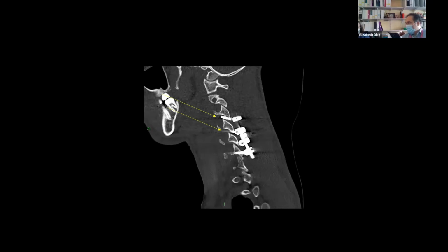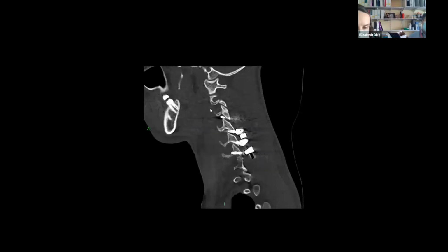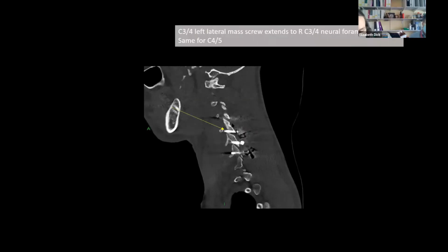And then obviously in terms of comments, Elizabeth, what do you think? Has anyone sent any comments about what they think of the position of the lateral mass screws? So we've got a comment from Marcella suggesting that the screws are through the facet joint and potentially impinging on the foramina. Yeah, that's exactly right, isn't it? So we can see the screw here. This is C3, 4, and C4, 5. Those screws are actually in the facet joint. As you say, Marcella, they're protruding anteriorly into the neural foraminae and potentially impinging on the exiting nerve roots. So that's not optimal.